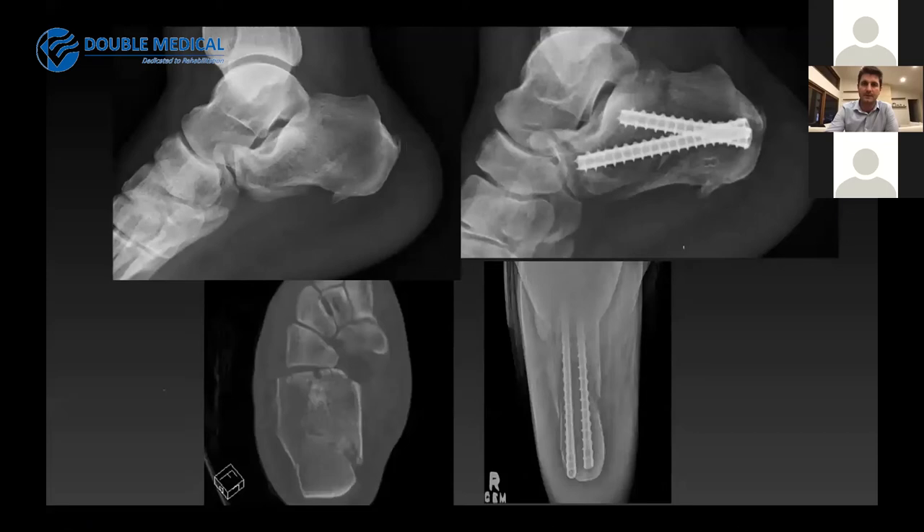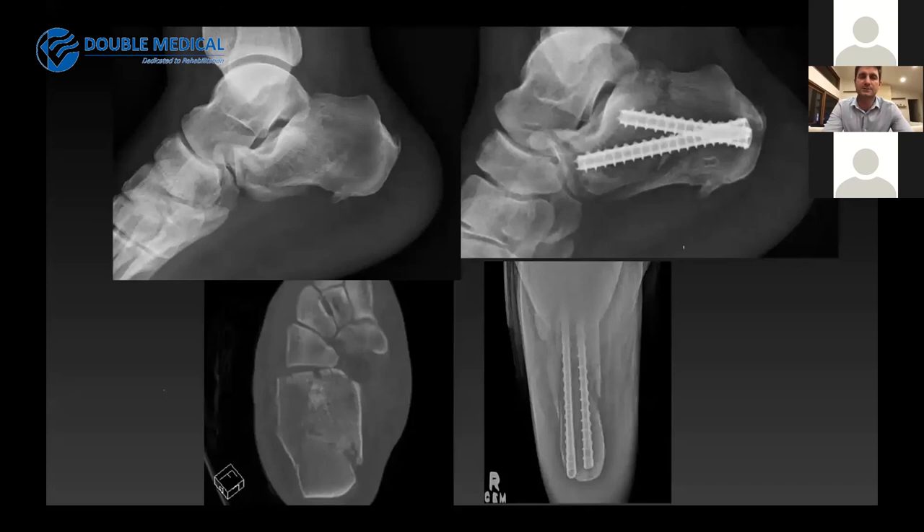Not all calcaneal fractures have an intra-articular component. This fracture was extra-articular at the subtalar joint and therefore does not need a rafting screw, but the two screws do hold the calcaneum in an anatomical position to allow bony union. For patients with a tongue-type fracture pattern, starting the screws in the proximal fragment and aiming them inferiorly not only rafts the articular surface at the subtalar joint but also provides adequate fixation for the tongue fragment.